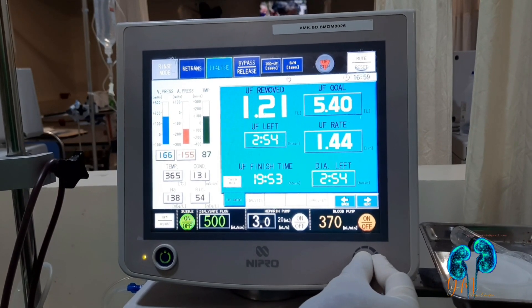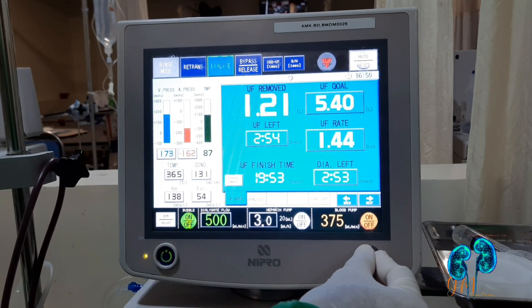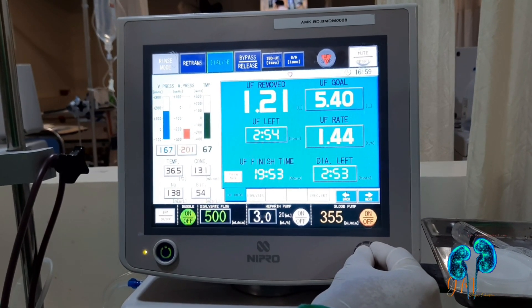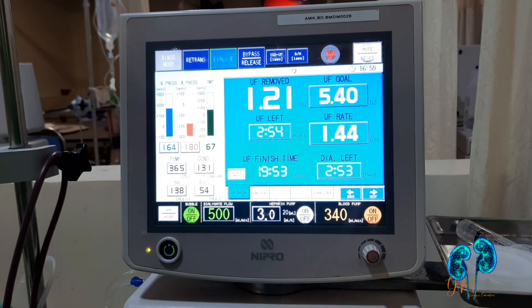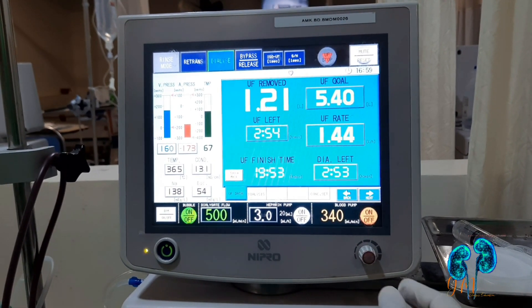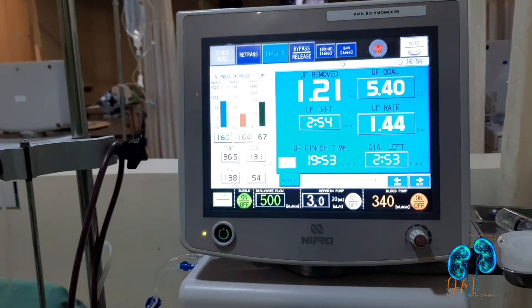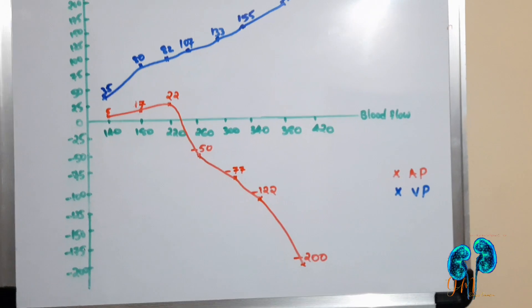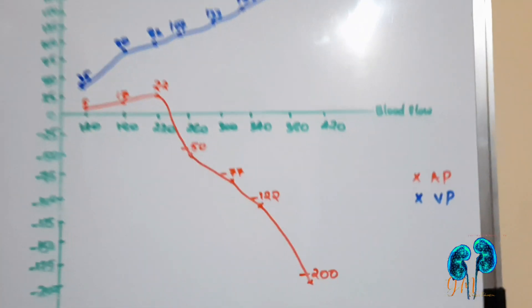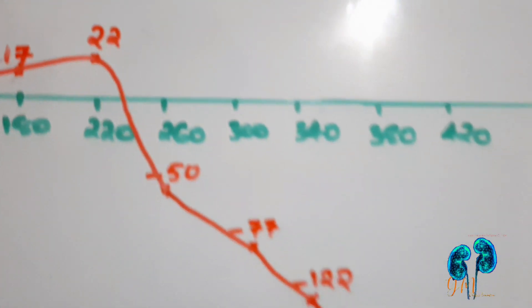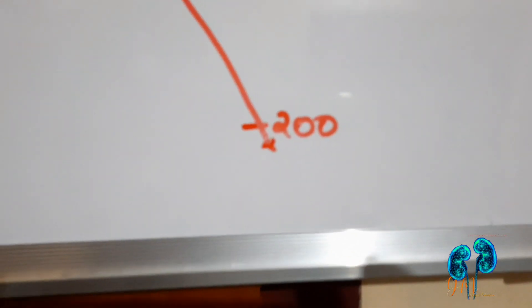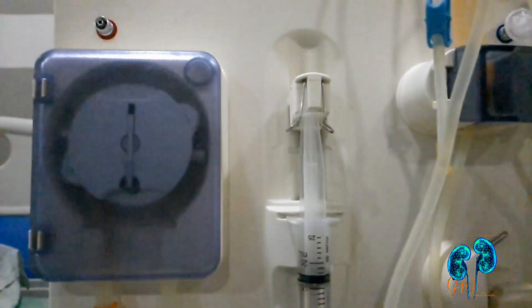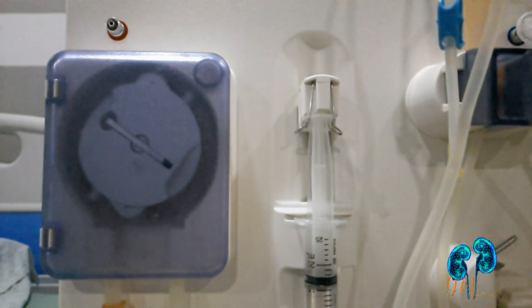At 380 ml per minute blood flow, there is a rapid decline in arterial pressure going up to -200. So we reduce by 40 ml per minute back to 340, which is the maximum blood flow. The diagram shows a rapid decline from 340 to 380, so the maximum blood flow we can keep is 340 ml per minute.